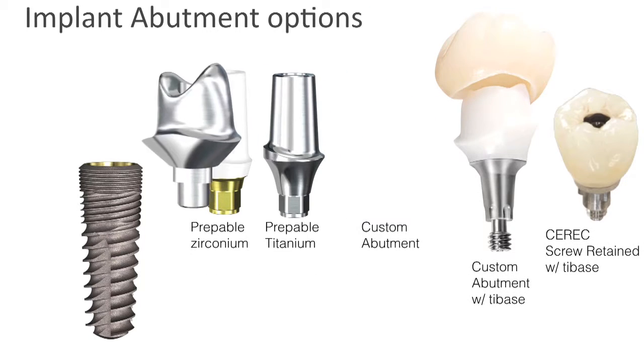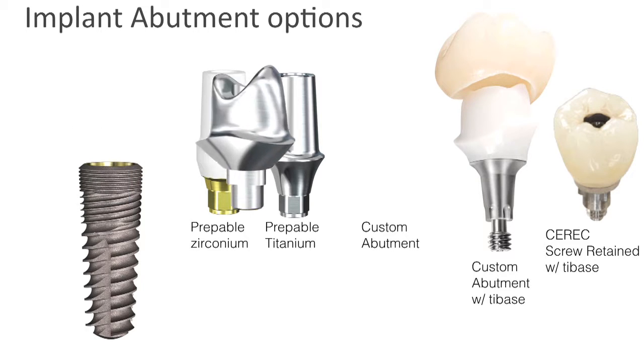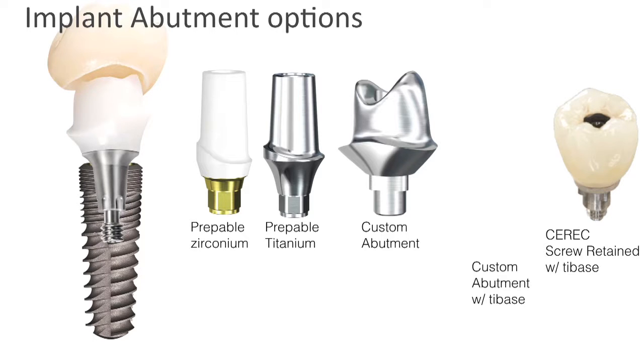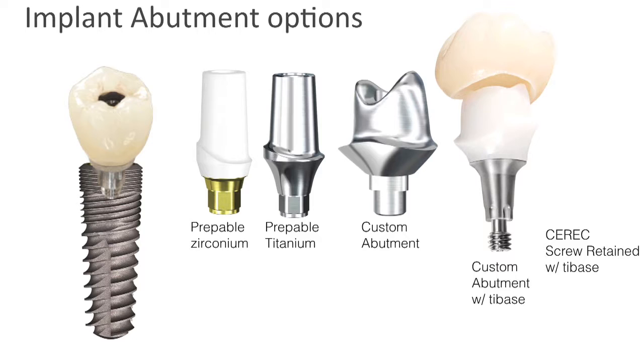I'm a big fan of custom abutments because of that. You can raise the margin of the abutment to the tissue. It's harder to do when it's all titanium because you don't want to see the gray of the titanium. But my favorite thing is to do a custom abutment with a Ti base. The bottom part is titanium, but the customizable top part is either zirconium or lithium disilicate. You make it and it bonds to your Ti base, and that's what you use.